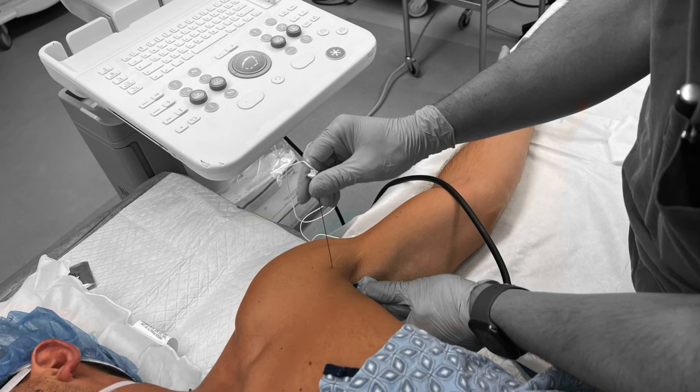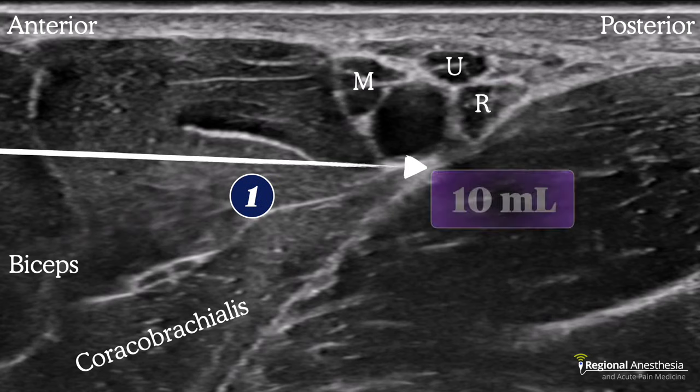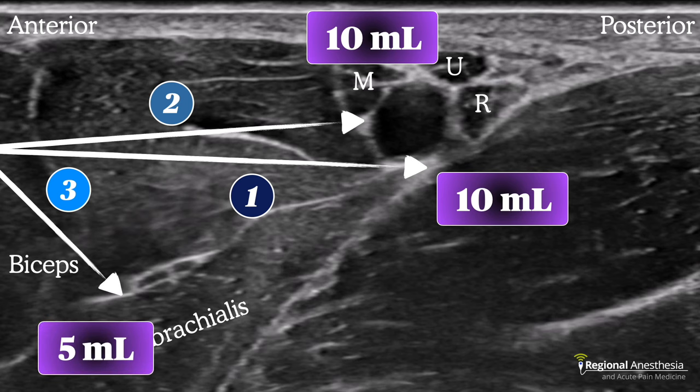Once you're happy with the image, the needle is inserted in-plane from the anterolateral aspect. To reliably block all four nerves, we recommend depositing local anesthetic in three locations. First, inject 10 mls deep to the artery next to the radial nerve. Then redirect and place 10 mls superficial to the artery to anesthetize the median and ulnar nerves — careful hydrodissection with saline or local may be needed to peel the nerves off the artery.